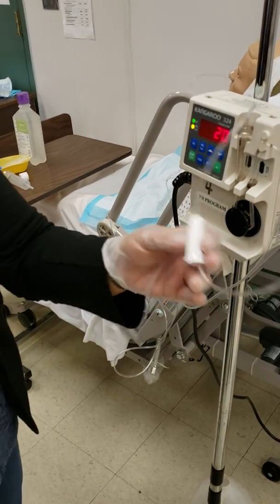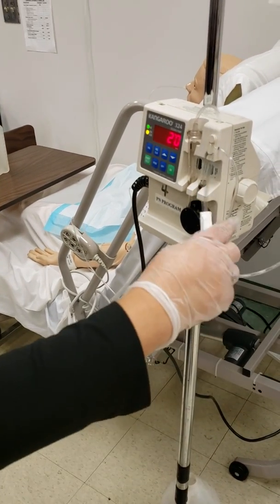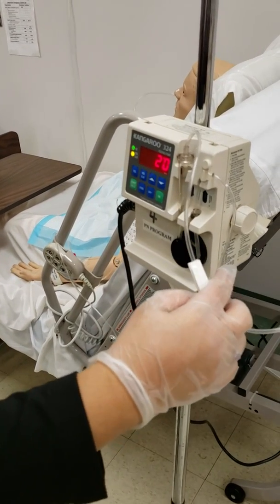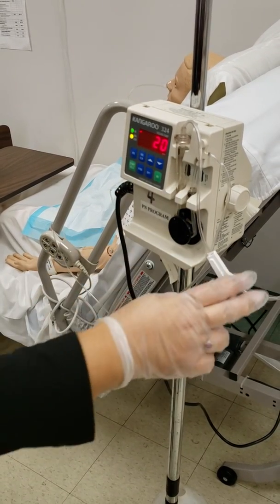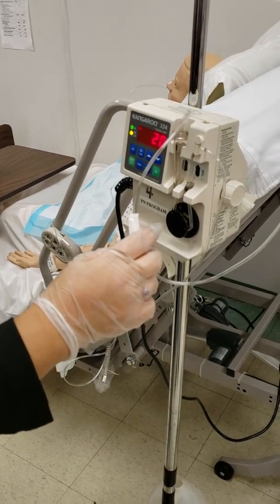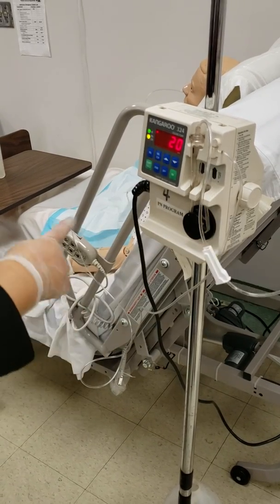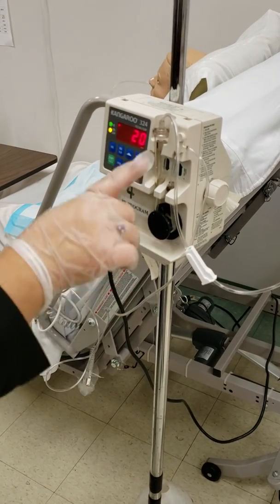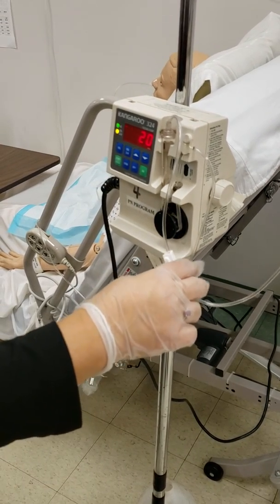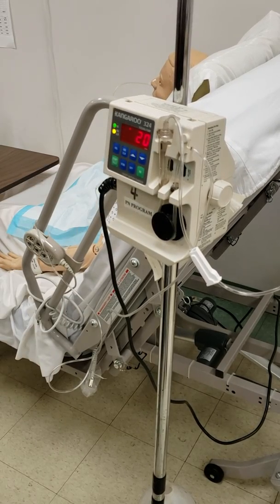First of all, there's only air. Second, it's clamped. So you have to open this after you thread it over here. Because if it's not threaded over there, it's gonna just siphon out. So thread it first, then you open, once you have all the numbers in before you start.